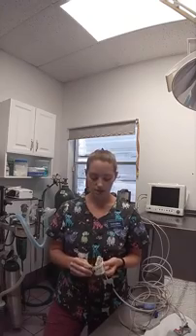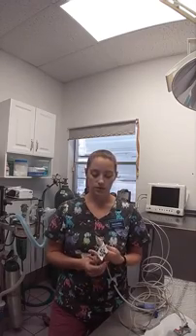to put the cuff around, and it's measuring the systolic blood pressure, the diastolic blood pressure, along with the mean arterial pressure. And so the normal range for the systolic would be 110 to 160, but you'd want to notify the veterinarian if it was under 80. For the mean arterial pressure, you'd want it to be between 60 and 90, and if it's under 60, then you would notify the veterinarian.